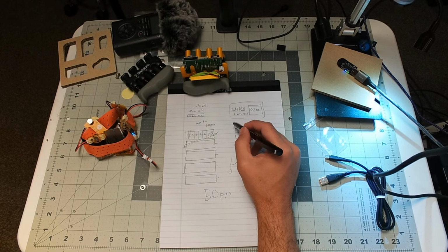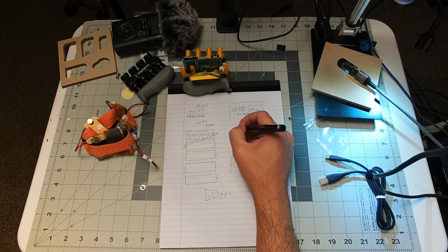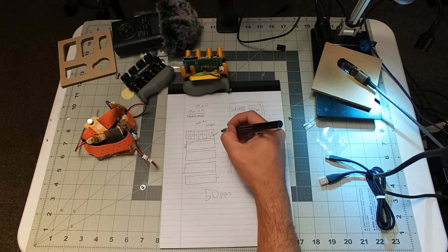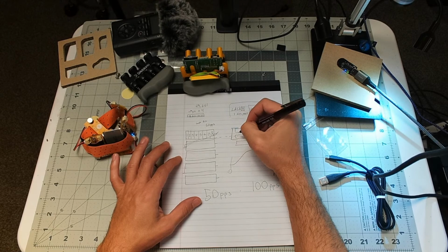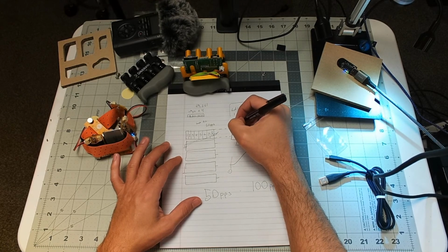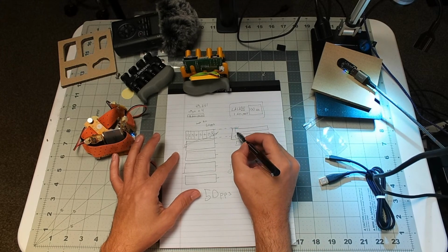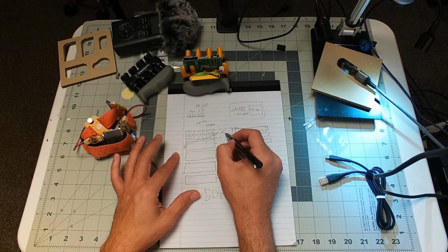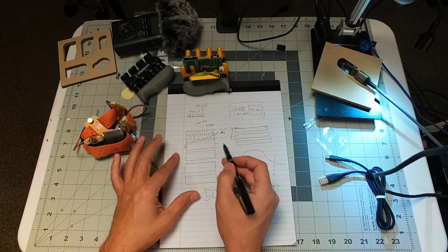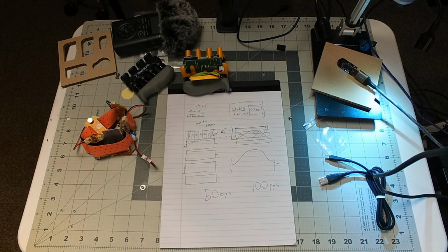And luckily, since we have twice as many of these packets, as you can see that these are twice as shallow, we are going to have to find the one that most closely matches. We're not going to do any guessing. We're going to do real values. So the one packet here that is the closest, we're going to set it to the row for this and cross out the second section.